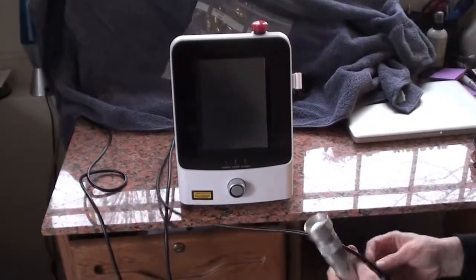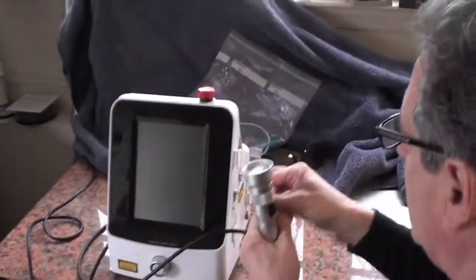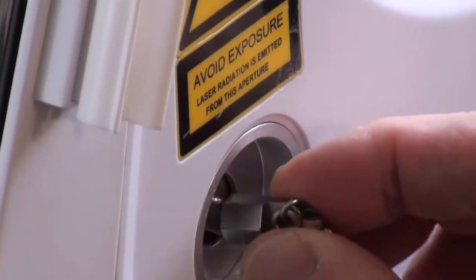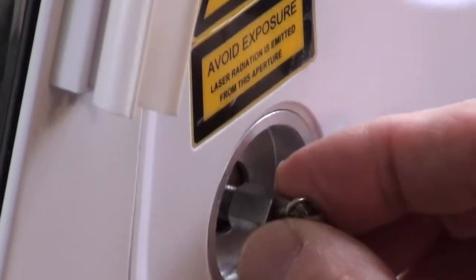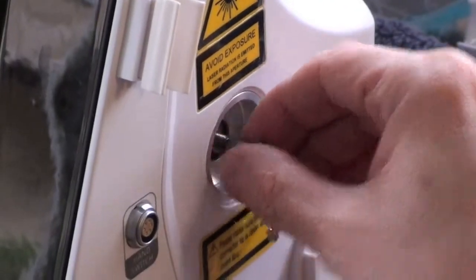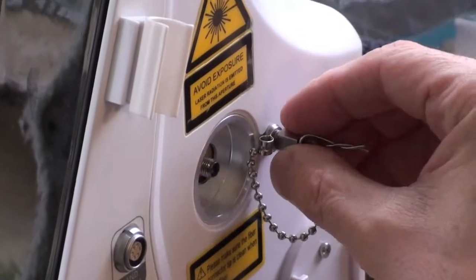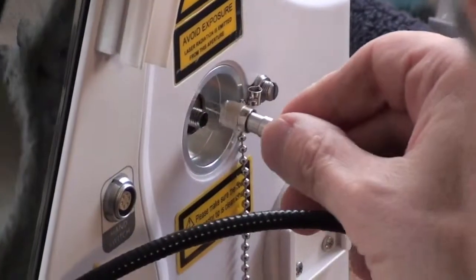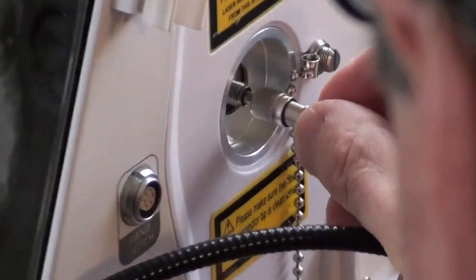This is your fiber. The fiber should have a cap on it. And by the way, when this is not being used, you always take this metal screw and you screw it on. You don't want to get any lint or dirt inside it. So you screw this on and you can store this right here or let it drop. This should have a cap on it too. You push it in and you turn it finger tight.